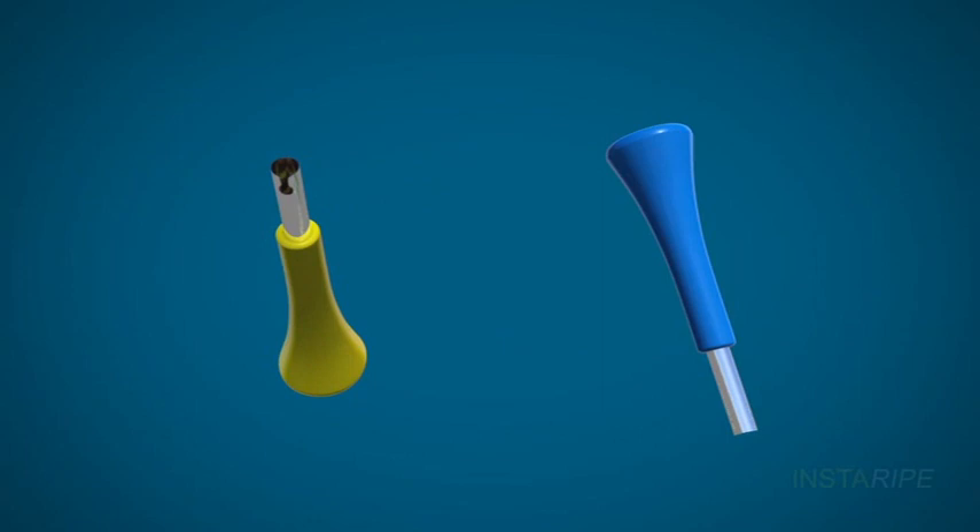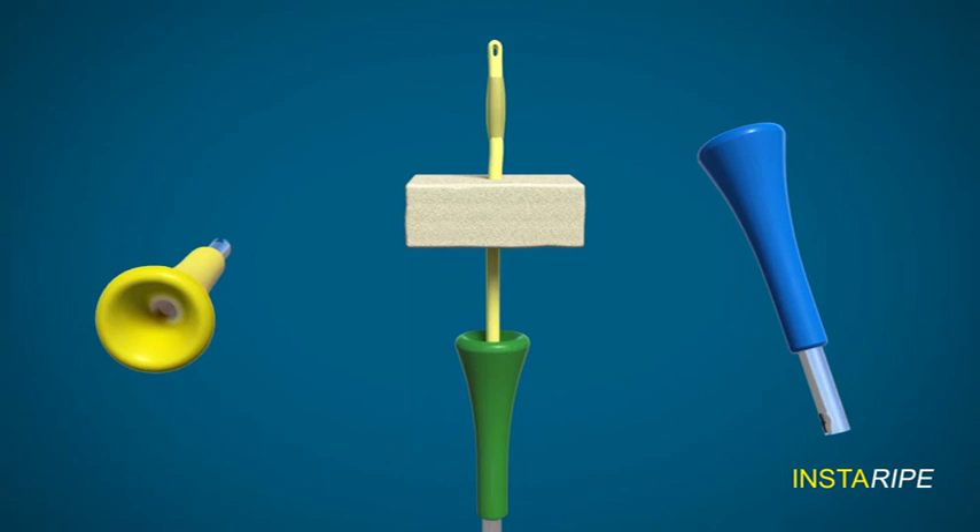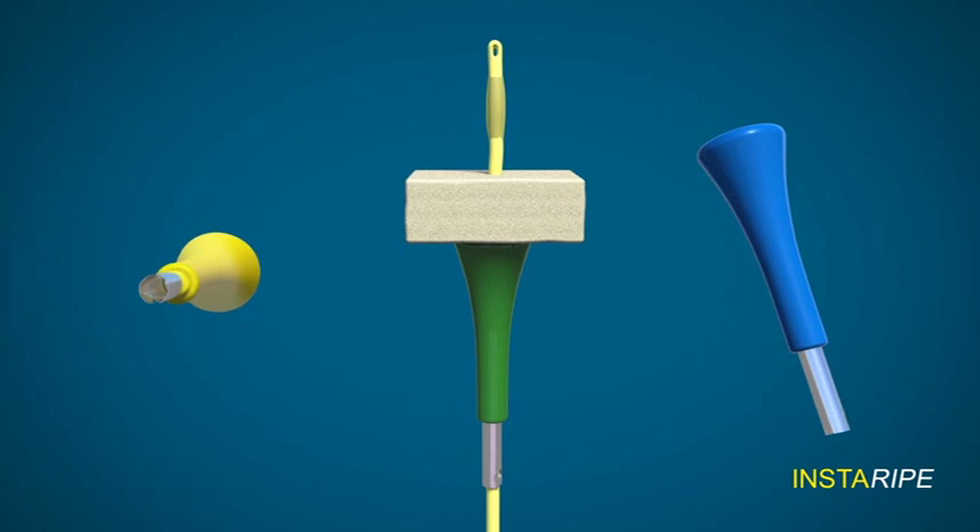This is the soft, silicone, autoclavable and reusable cervical ripening device invented by me. The Foley's catheter is first introduced through this device and then into the extra amniotic space through the cervical canal, and the bulb is inflated.